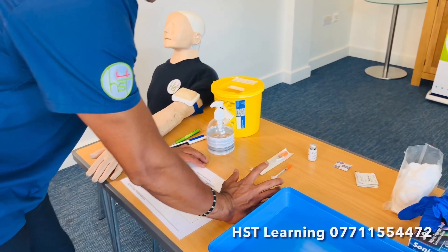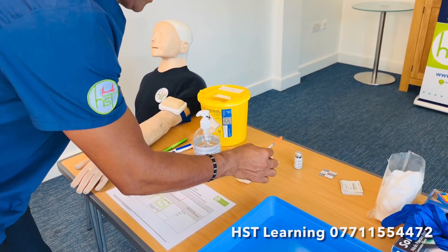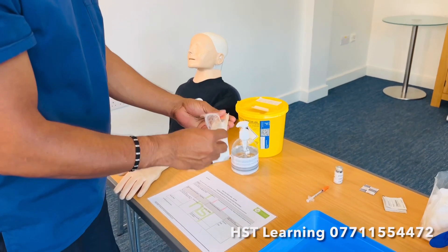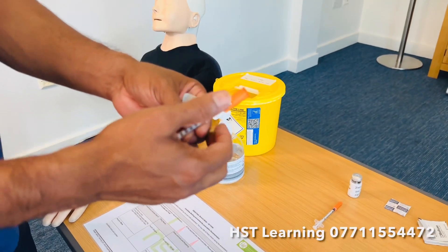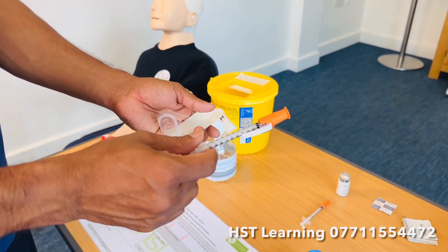You have these syringes here — you can get a normal syringe without the safety cap, and the second one is the syringe with the safety white cap. That white cap is where you can push it at the end and throw it into the sharp bin, which I'm going to show you while I'm doing the procedure.